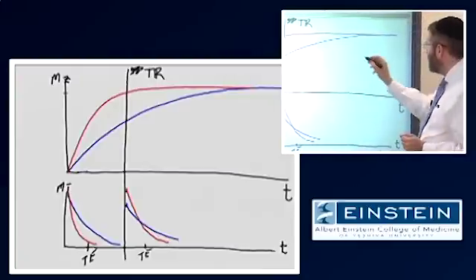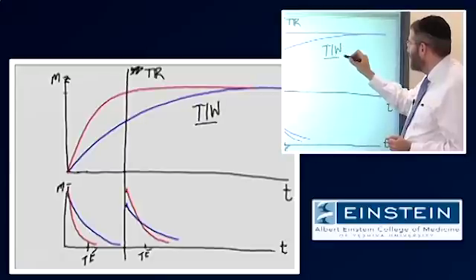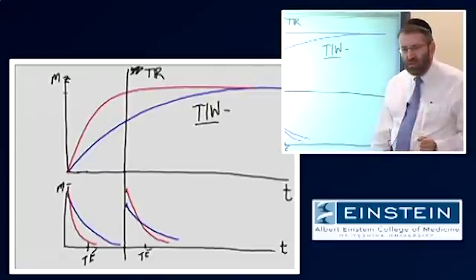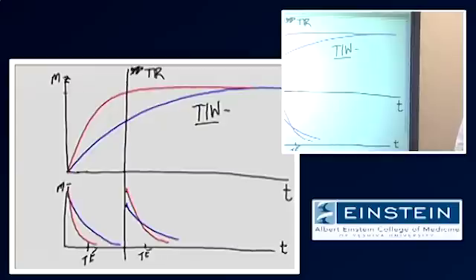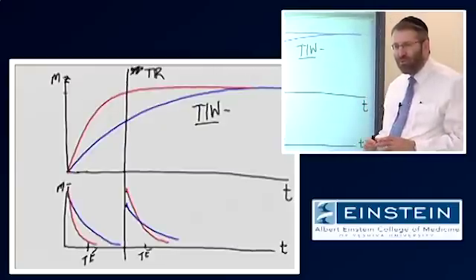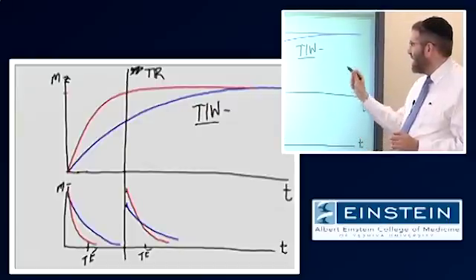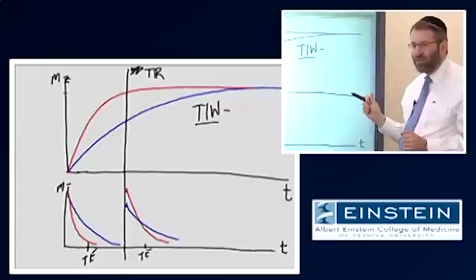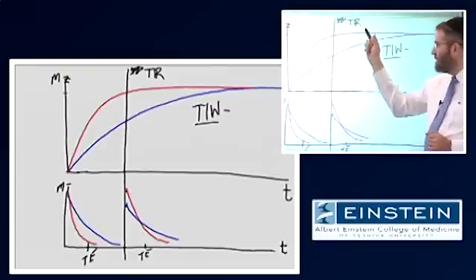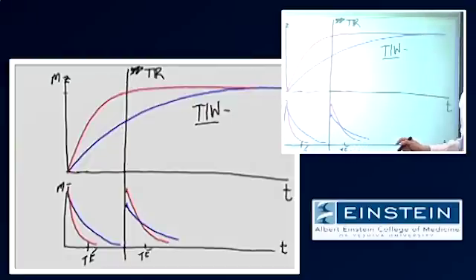So if we say that we want to make an image that is T1 weighted, and I'm sure in the review book there's probably a nice little table to memorize this. If you want to make a T1 weighted image, how would you choose these two parameters, TR and TE?